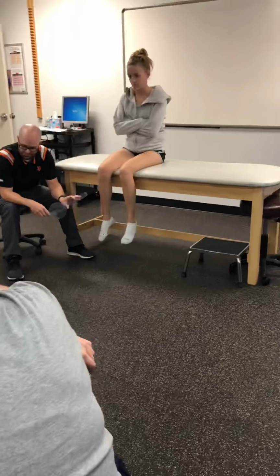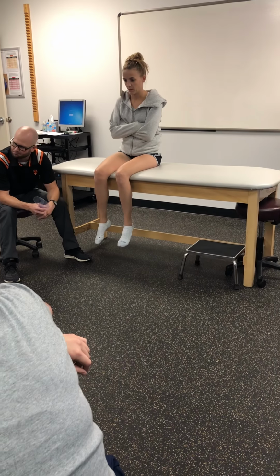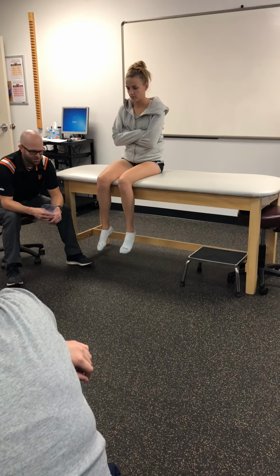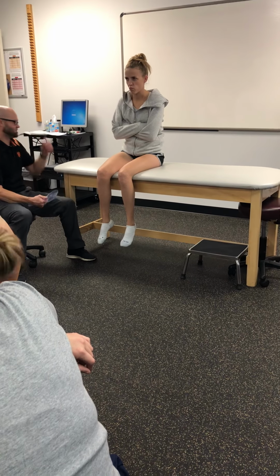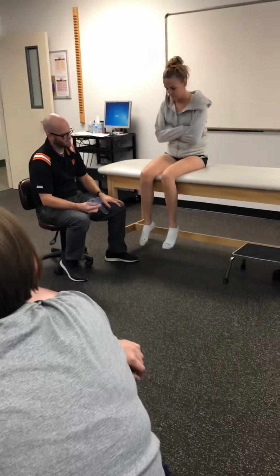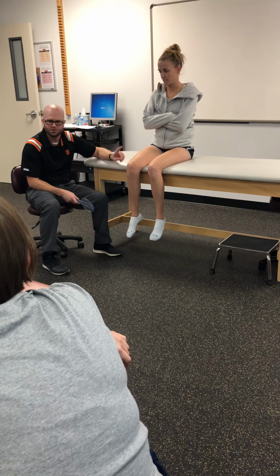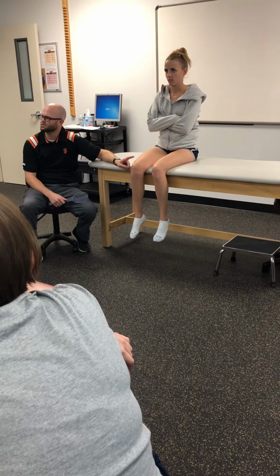30 to 45. What about external rotation? Flip the page, Ellen. 32 to 50, or 30 to 50, I think is what we just made it, a little bit bigger. Okay, don't move, what does internal rotation look like?